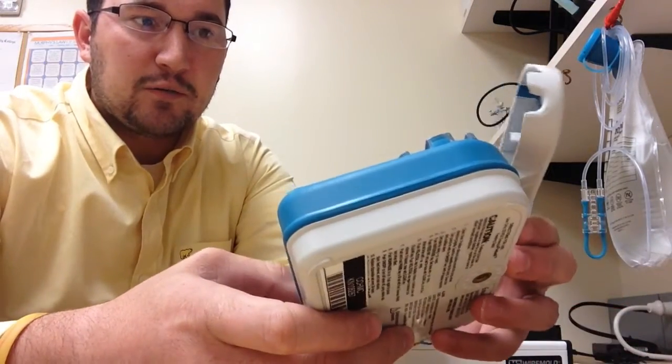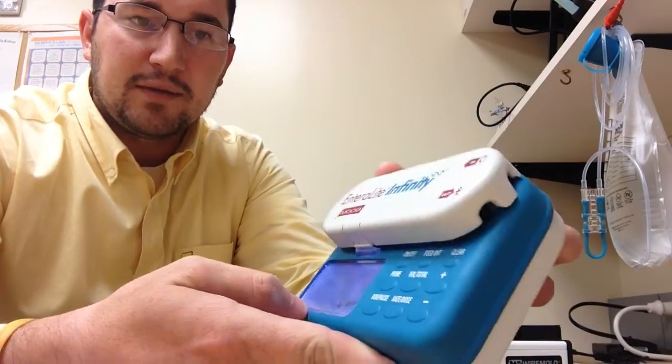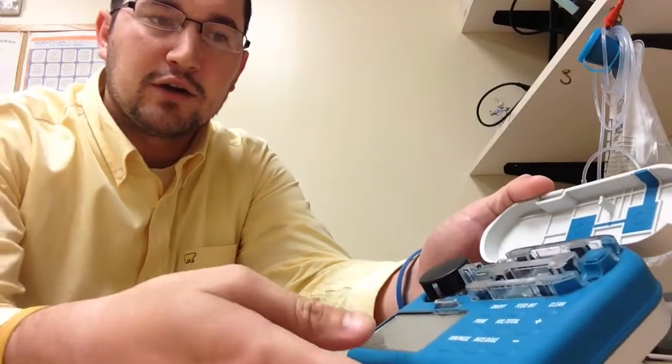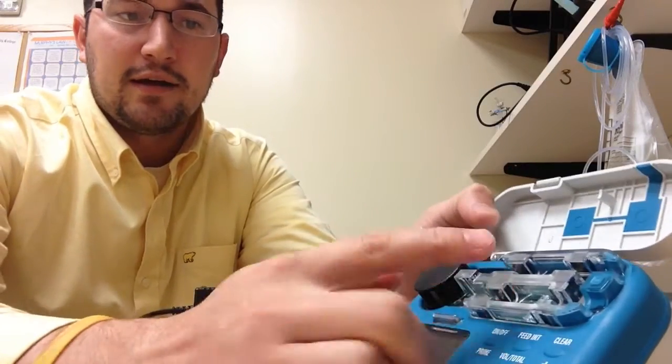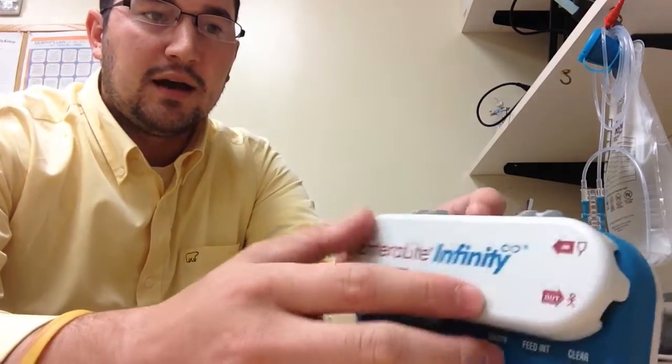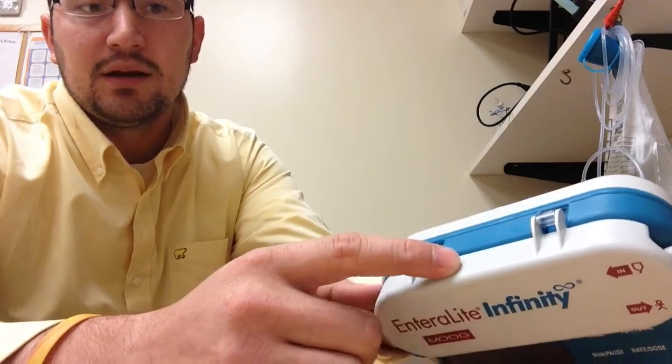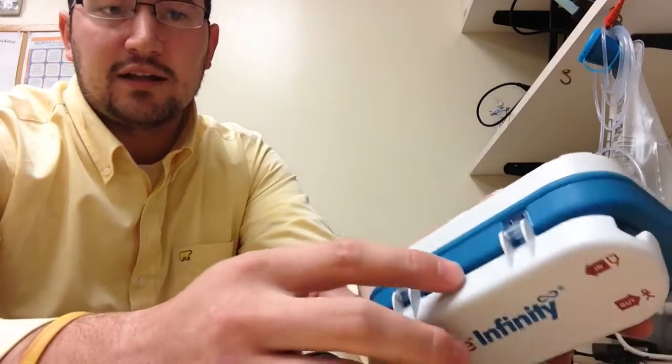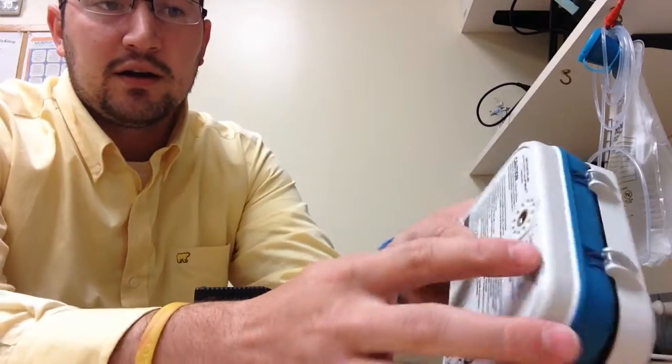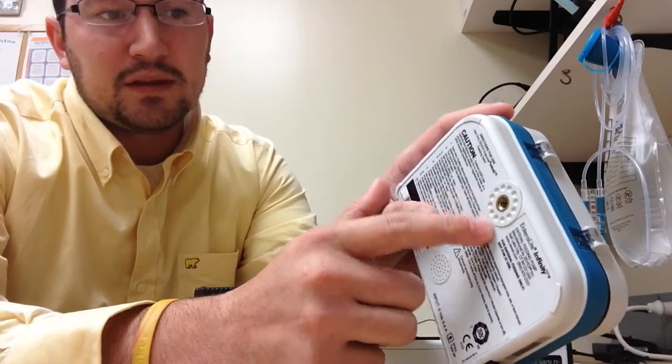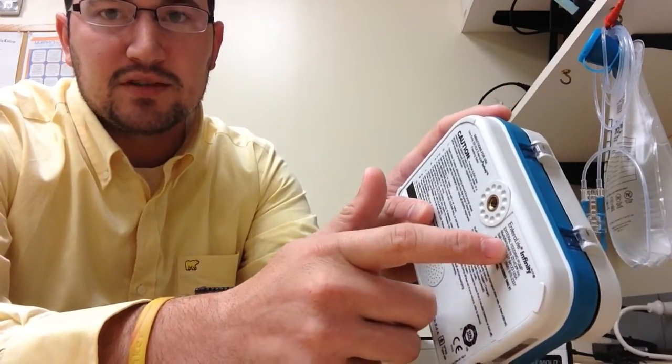Once you know that the battery works, you want to give the housing a good look over. As you can see here, you open up this door here. It's where the line goes in. On the back of the pump, you want to check. There's a lot of times there's cracks on the door and also here where they keep the attachment for IV pumps and poles.